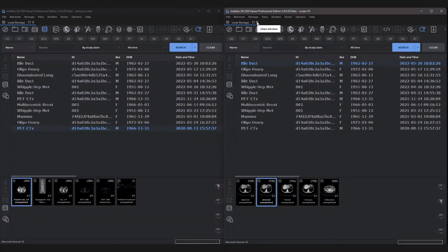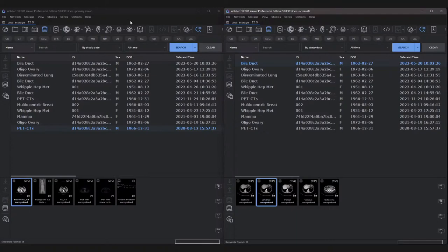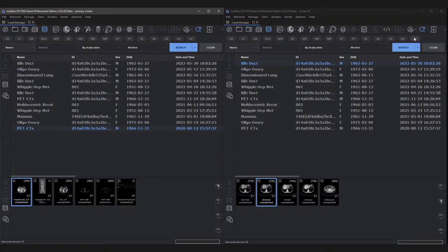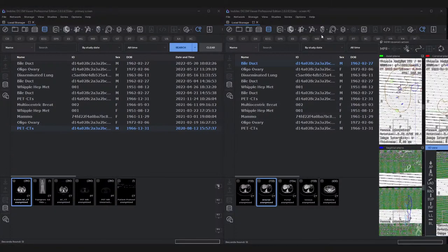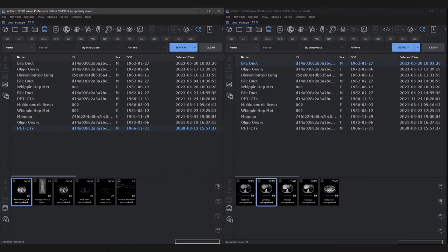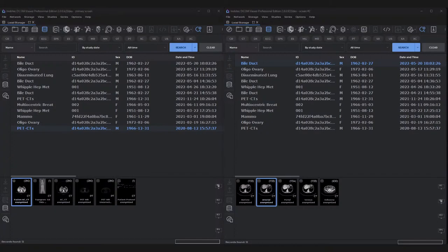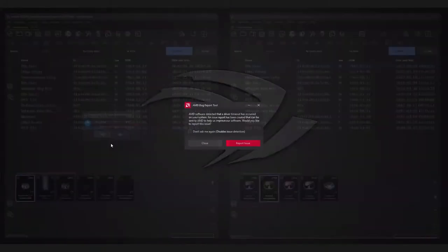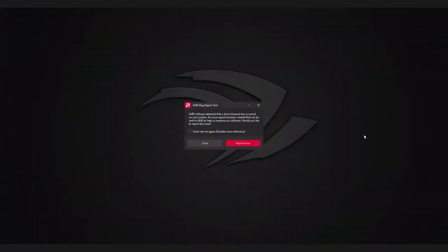I have selected the arterial phase of the exam and the native one to subtract the bones. Now the magic is happening. As you can see, we have a beautiful vessel analysis structure. I must note that I am using huge CT datasets. This is a whole body CT dataset done in 768 by 768 axial image resolution and 0.8 millimeter slices. So my datasets are huge and hence the memory overload issue because I've had open more than 15 studies in the background.